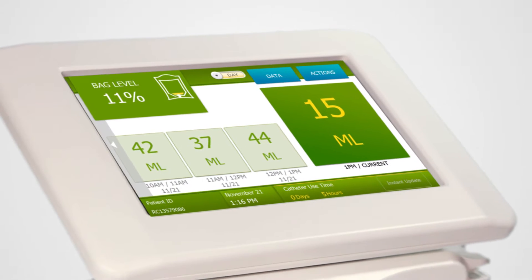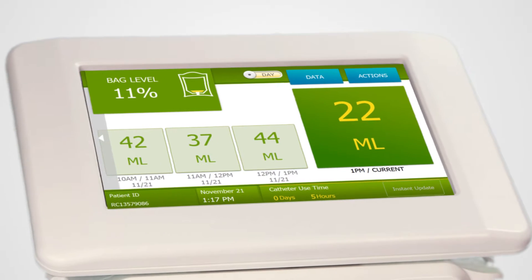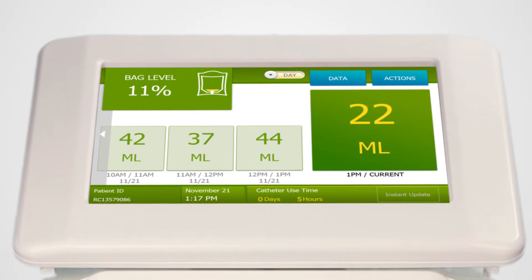Sensica UO continuously measures urine output, just like any other vital sign, without any hourly measurement on your part. And like any other vital sign, the hourly totals will be sent directly to your EHR.